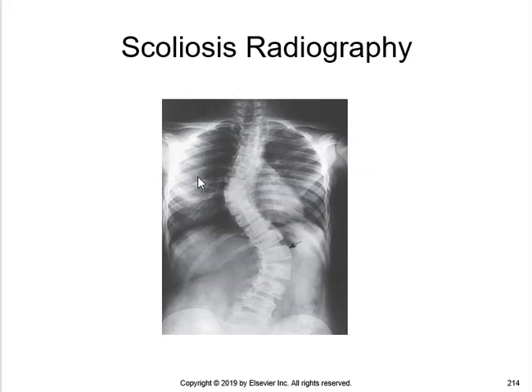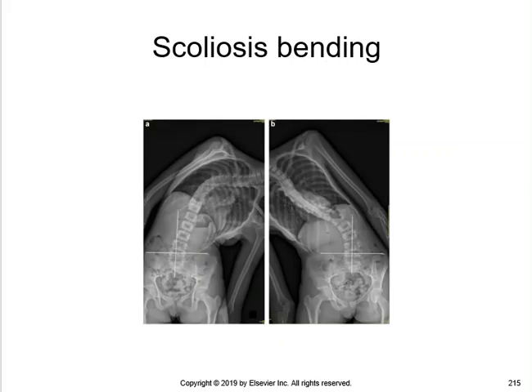It's important not to collimate in too far because with that lateral deviation of the spine, it's very easy to collimate off a portion of the anatomy that we want to see. So collimation is important, but always remember that if you collimate to the point that you have to repeat, then the radiation safety benefits that the collimation would afford are totally wasted, and you've more than doubled the patient's dose, or at least doubled the patient's dose.